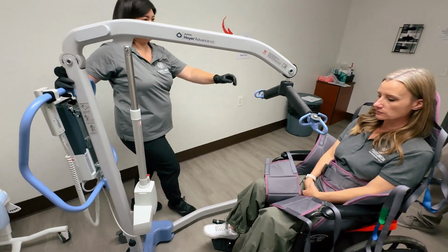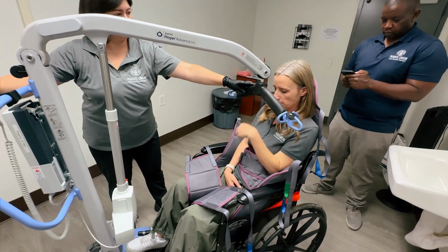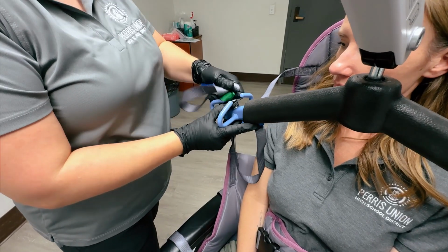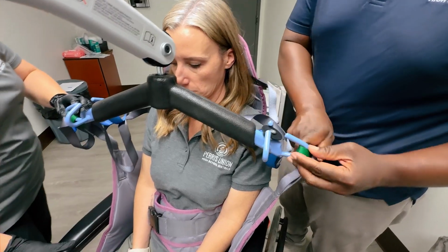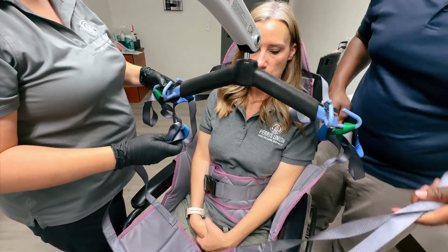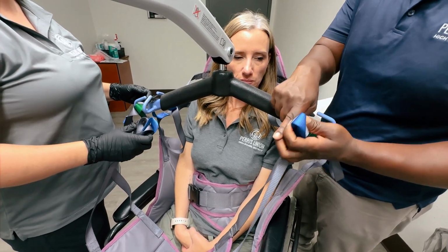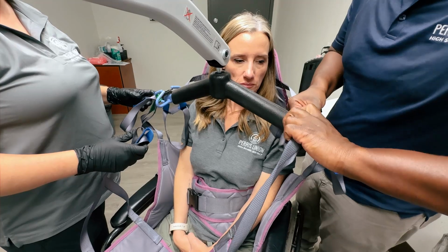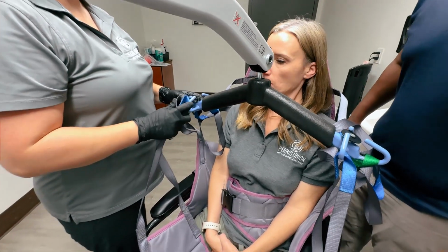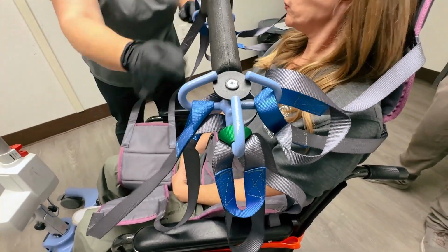Bring the Hoyer lift bar over to the student and lower it, being mindful not to let the bar come into contact with the student's face. Hook the loops of the straps over the hooks on the bar. Peel back the gray part of the strap to expose the colored loop before attaching the colored loop to the hooks. Each strap has a series of loops. Match the corresponding colors on each side of the sling. Tops are the same color loop, middle are the same color, and the bottom are the same color loops.